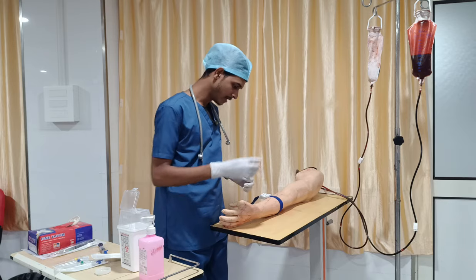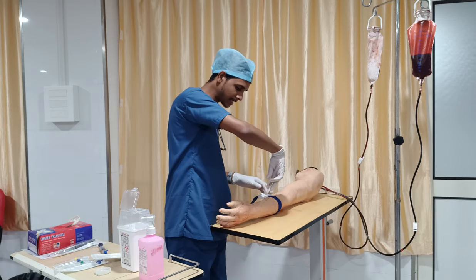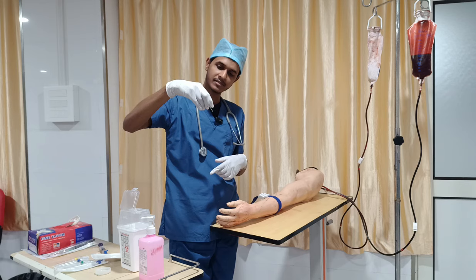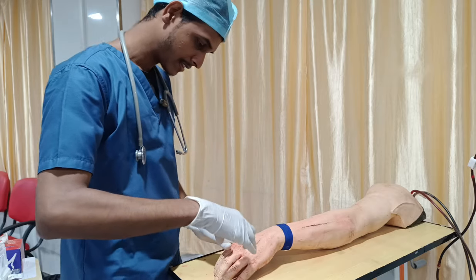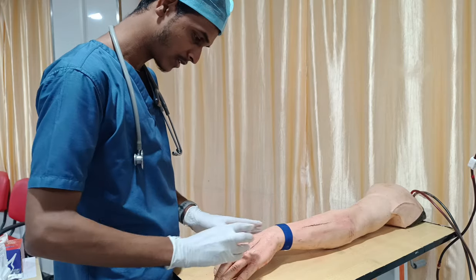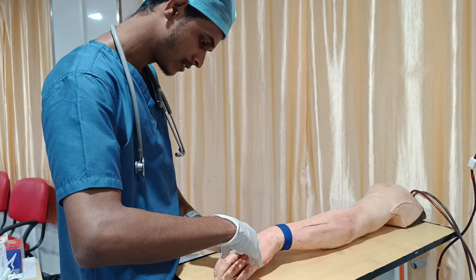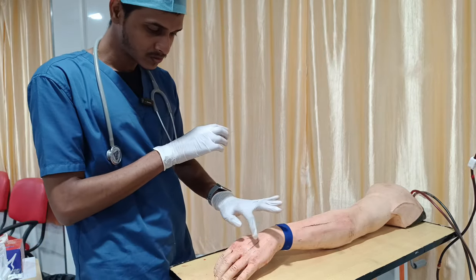If you keep the cannula at 90 degrees, 45 degrees is this much, and 30 degrees is somewhat less. So I am carrying the catheter at a 30 to 45 degree angle, and here I am maintaining about a 30 degree angle. Give a lateral pressure slightly, as the vein is coursing like this.